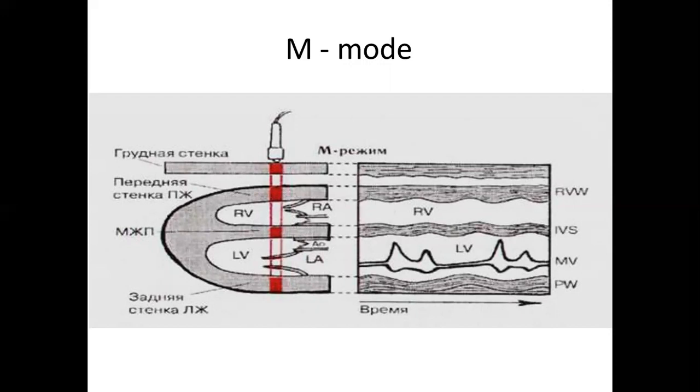And if you switch your attention onto the right side of the slide, you will see these echoic linear zones.